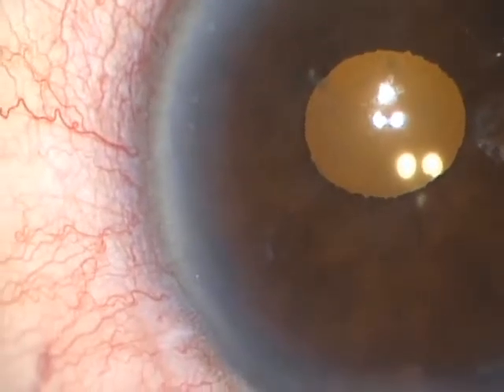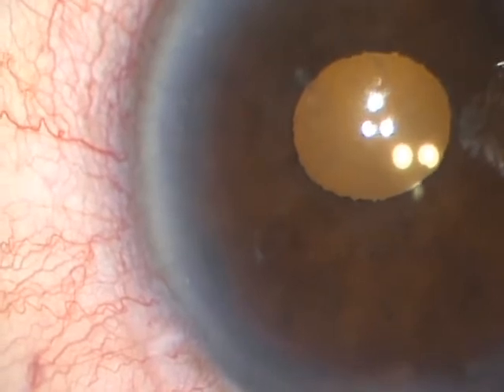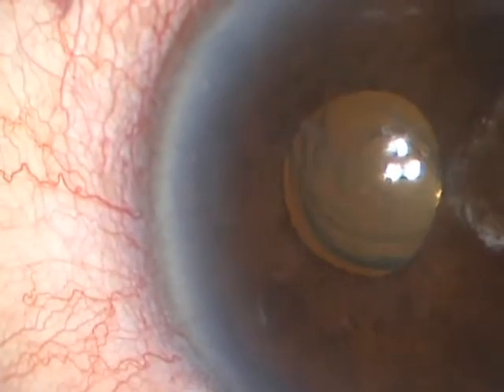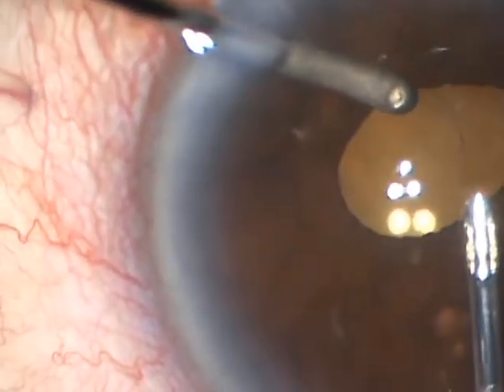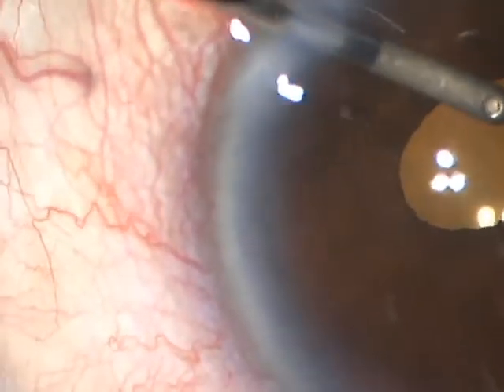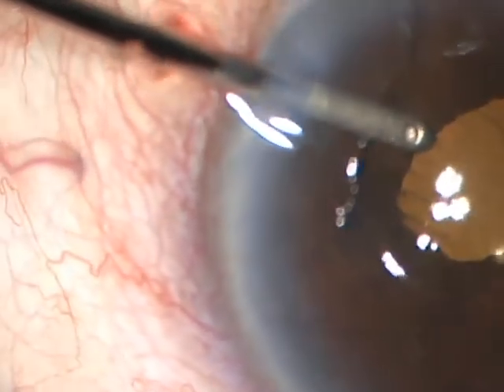One of the complications you'd rather not experience is rupture of the cyst. Here's a patient undergoing cyst filling with alcohol where the cyst wall ruptures. In the pupil you can see the Schlieren flow of the ethanol as it mixes with the viscoelastic and the aqueous. Because the cyst was isolated with viscoelastic, irrigation was successful in removing the alcohol, and post-operatively the patient did not suffer any loss of endothelial cells or significant inflammation. Unfortunately the cyst did recur, but we were able to re-inject it with ethanol at a later date with resolution of the cyst.